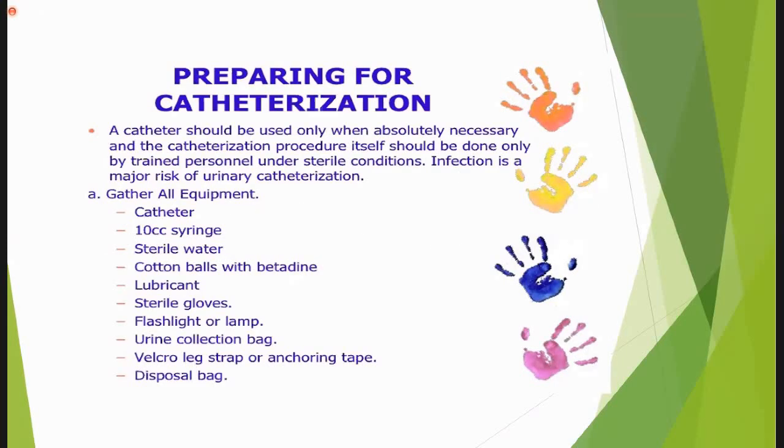Preparing for catheterization. A catheter should be used only when absolutely necessary, and the catheterization procedure itself should be done only by trained personnel under sterile conditions. Infection is a major risk of urinary catheterization.